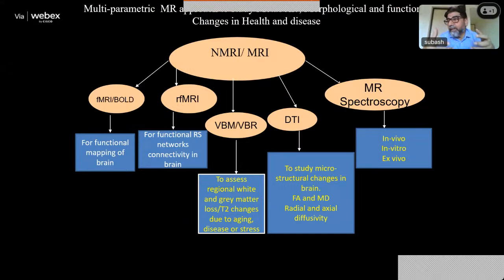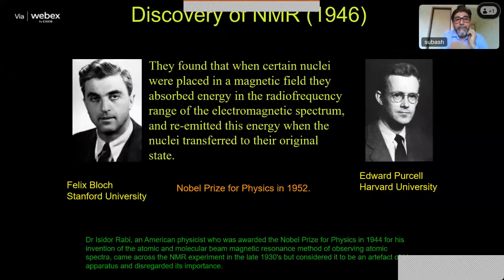Anything you design in your experiment, you can actually look at how the diffusion, these tractography, the changes happen in the white matter fiber tracts. Then you can also use, based on chemical shift, the MR spectroscopy in different conditions.